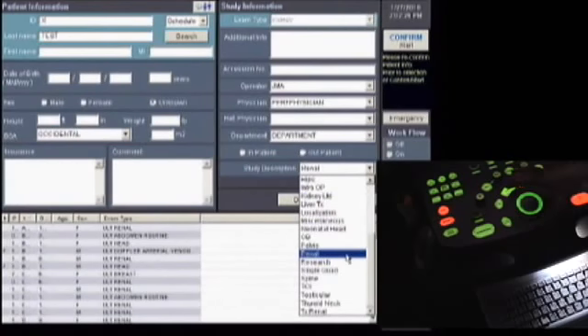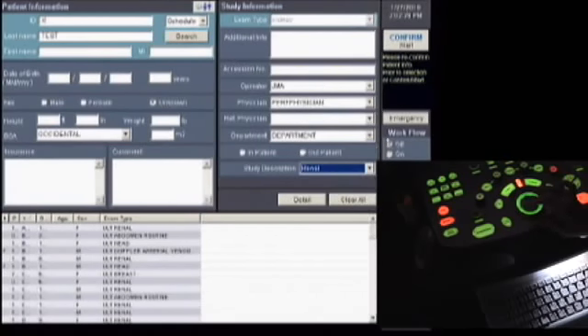Use the trackball and the set button to select Renal. Then we're going to select Emergency for purposes of PACS entering. And then to begin the examination, press Confirm or Start using the set button.